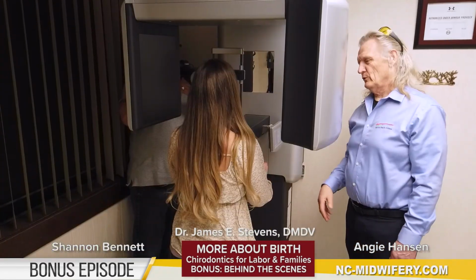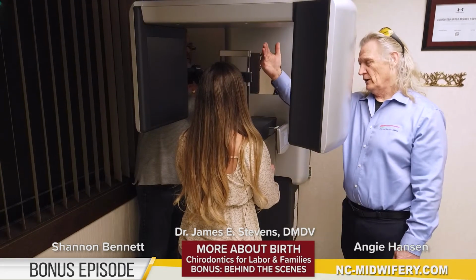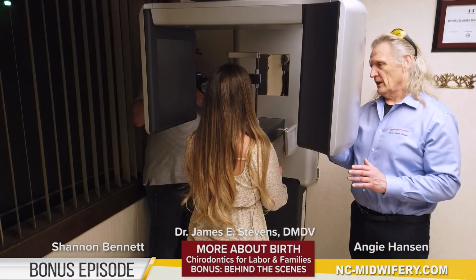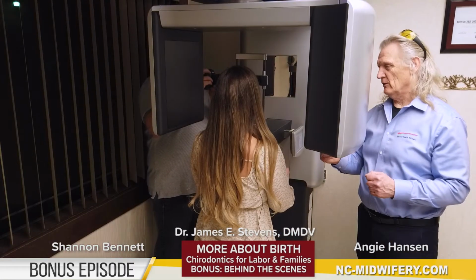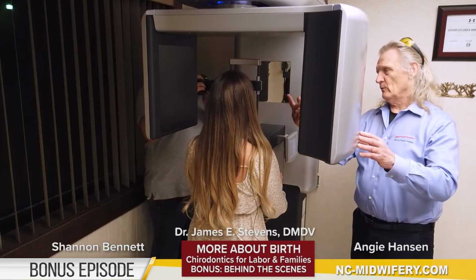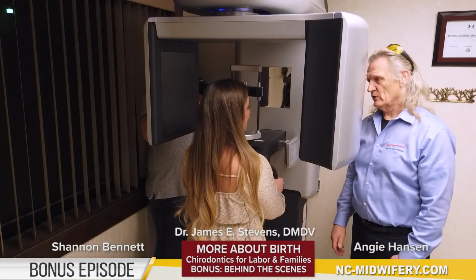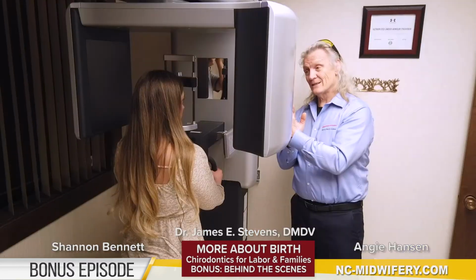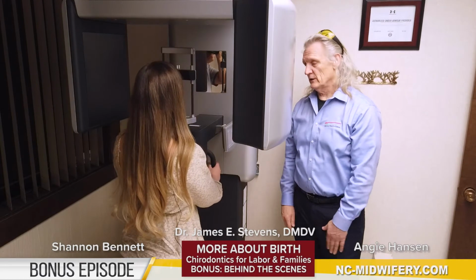Now I'll go over to the computer and line this machine up so that you're aligned horizontally and vertically. Once we get that alignment done, then we have you just breathe through your nose, close your eyes, swallow, and keep your teeth together so that everything is absolutely stable. Then this arm will swing around. It goes around one time, takes 10 seconds, and bang, we have our scan. Nice. Much more simple than a CAT scan, a lot less radiation. The CAT scan goes around and it's shooting an X-ray every time. Oh, yeah. So a lot less radiation.